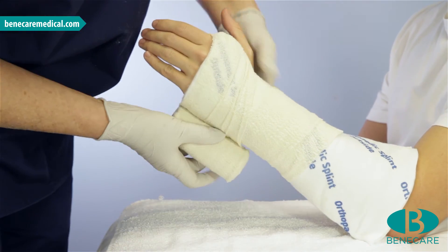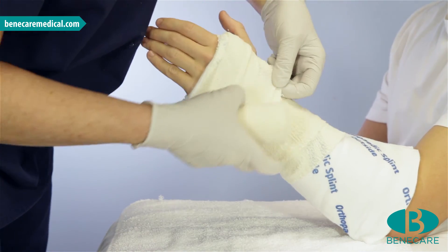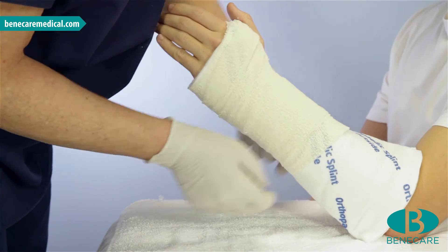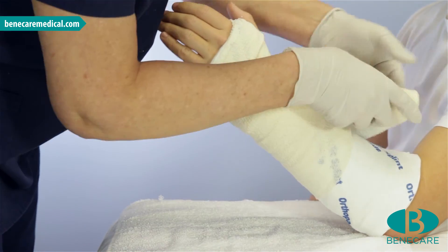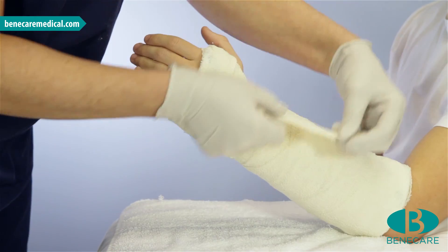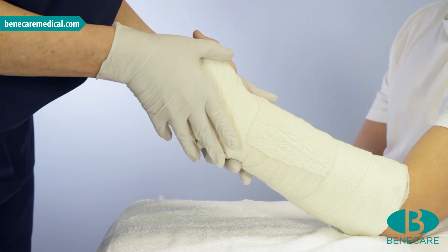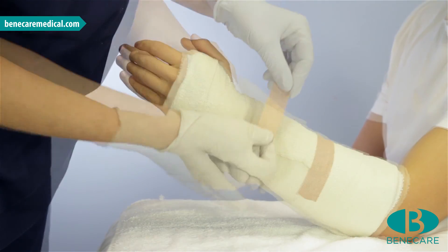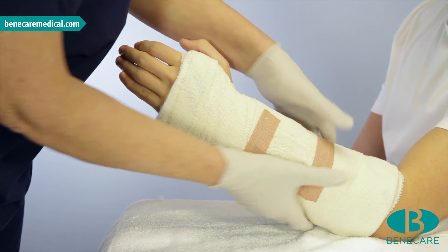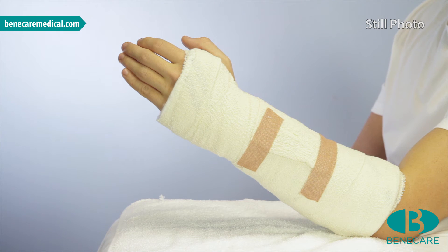Ensure the splint is smooth and ridge free during the application. Mould the cast to the contours of the limb and secure the end of the bandage with adhesive tape. Continue moulding until the splint has reached the initial set time and rest the limb on a pillow or soft table.